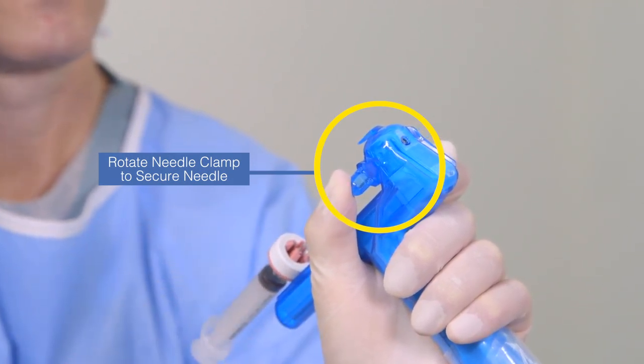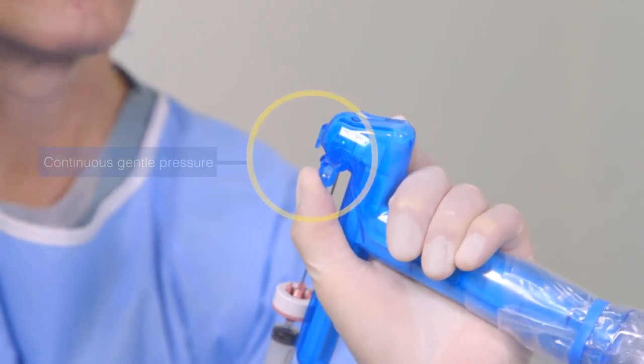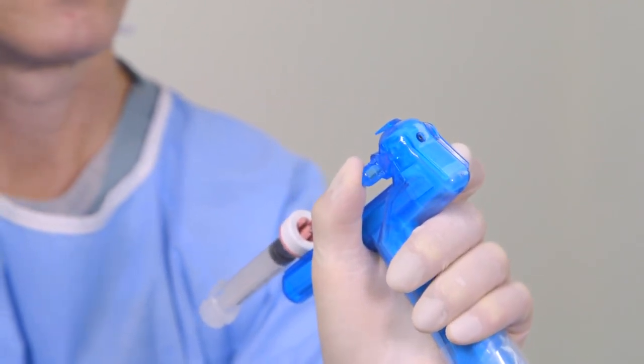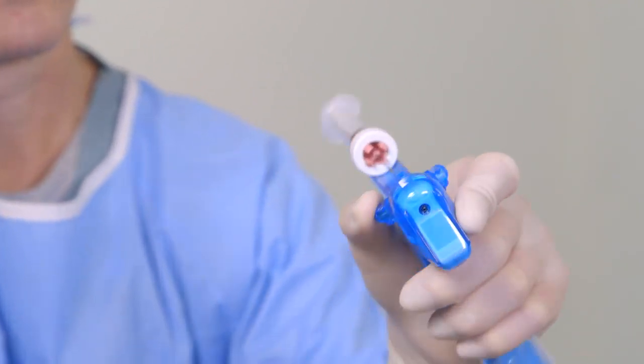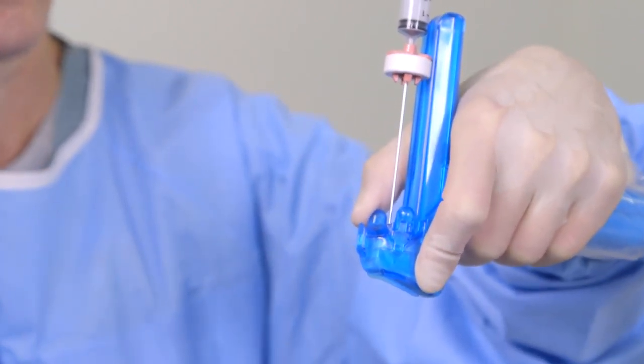Then, secure the needle in place by rotating the needle clamp backward with your thumb to the closed position. Check to be sure that the needle tip is not protruding from the bottom of the sterile shield. Hold continuous gentle pressure on the needle clamp to maintain the needle in its safe, retracted position during patient scanning, and until you are ready to advance the needle toward its target.